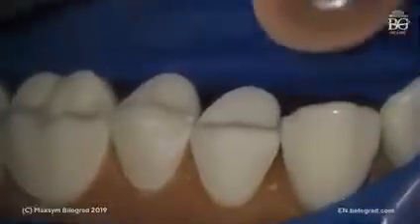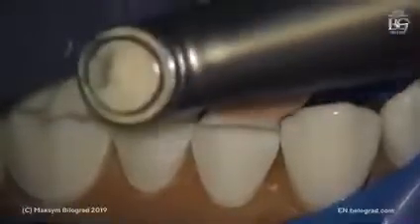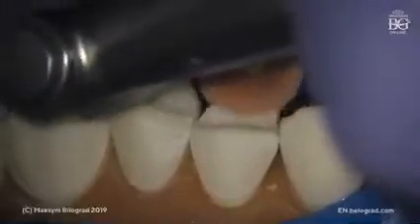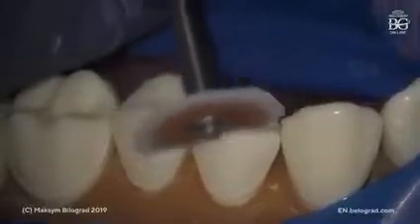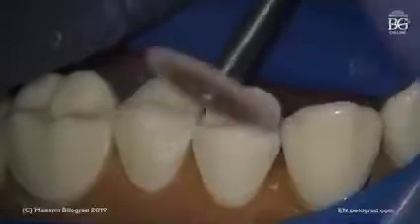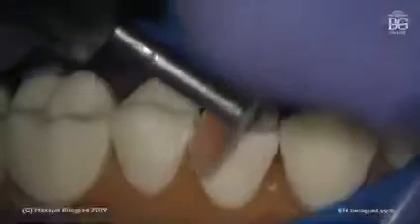For this premolar, we will continue with the disc with abrasive in front. We will just make smoothening here on the occlusal surface, also on the buccal surface, occlusal surface, buccal side. And that transition, you remember, as we mentioned before, has to be super smooth, and with the disc we can make it happen.